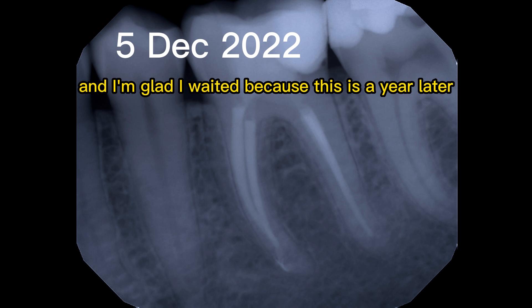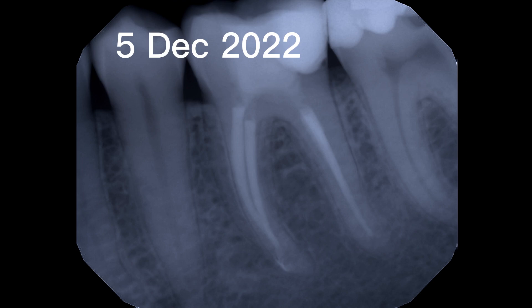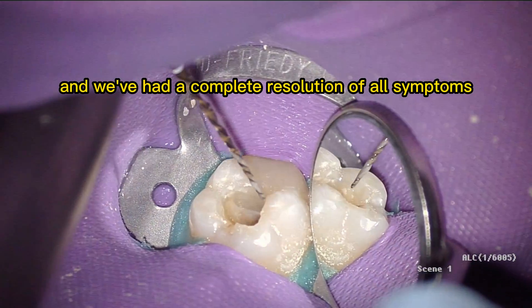A year later, the patient is asymptomatic and we've had complete resolution of all symptoms.